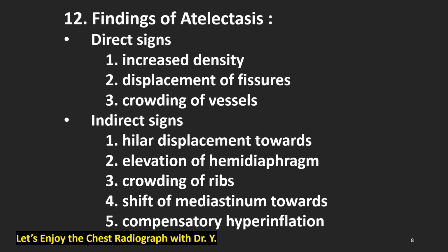Indirect signs: 1. Hilar displacement towards the lesion. 2. Elevation of hemidiaphragm. 3. Crowding of the ribs. 4. Shift of mediastinum towards the lesion. 5. Compensatory hyperinflation.